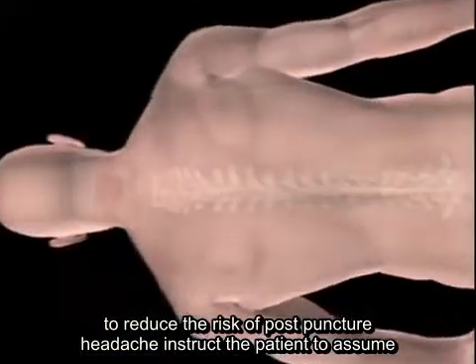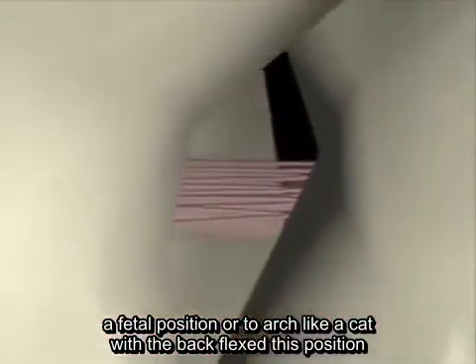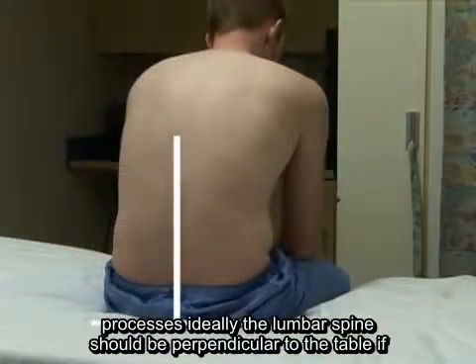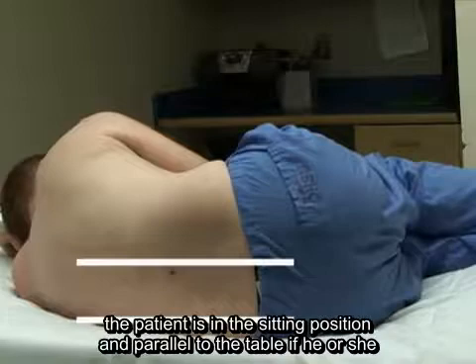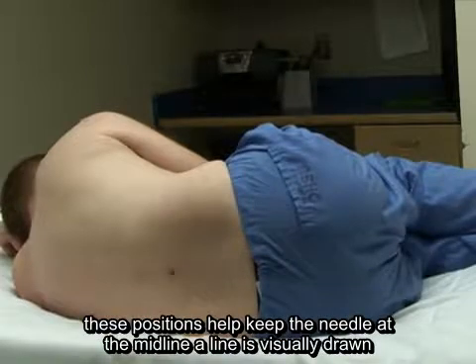Instruct the patient to assume a fetal position or to arch like a cat with the back flexed. This position widens the gap between the spinous processes. Ideally, the lumbar spine should be perpendicular to the table if the patient is in the sitting position and parallel to the table if he or she is in the lateral recumbent position. These positions help keep the needle at the midline.